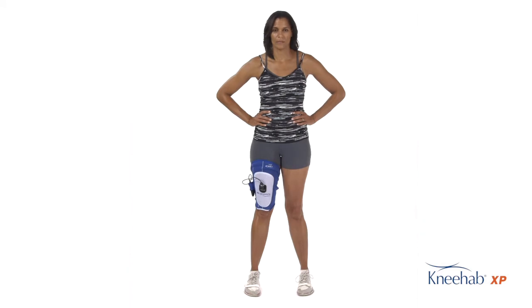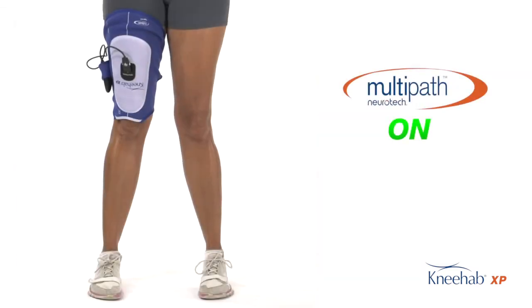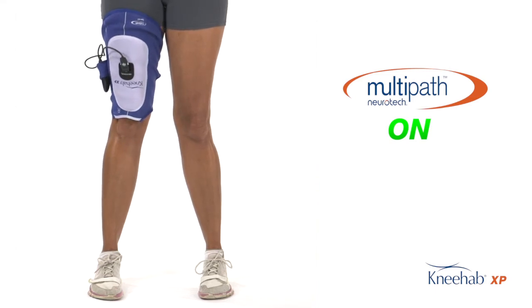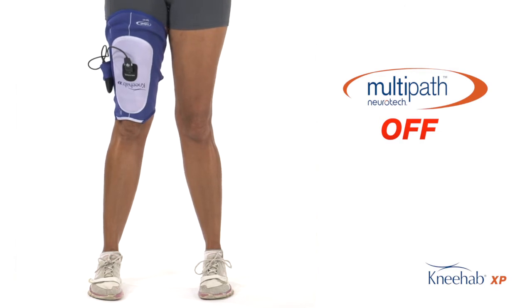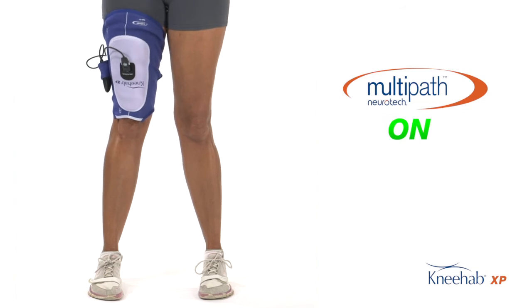For the level 1 exercise performed in stance, the patient stands with even weight on each leg. When the contraction of the device is felt to come on, the patient squeezes their quadricep muscle with that contraction and holds it for the duration of the contraction. When the device releases, the patient relaxes and still stands evenly on both legs. There is no need to increase the weight shifted onto the affected leg during these contractions. Even body weight should be maintained throughout this exercise.